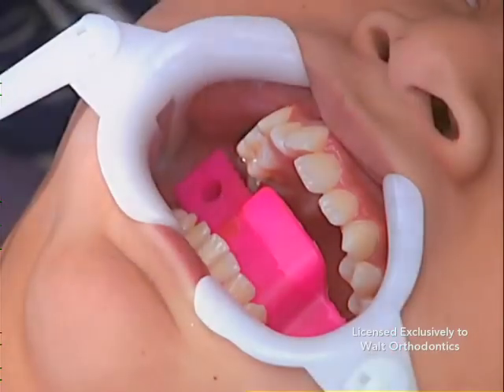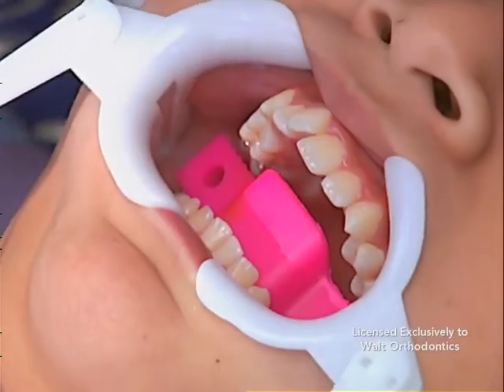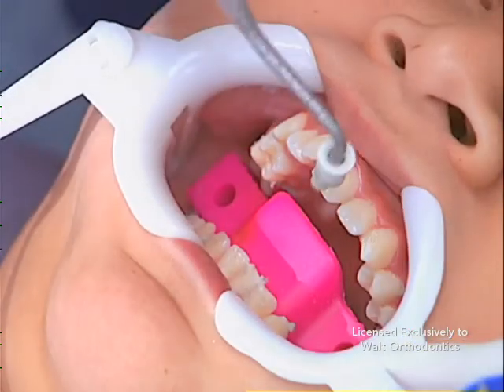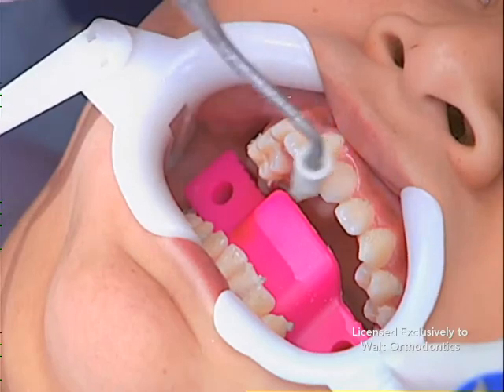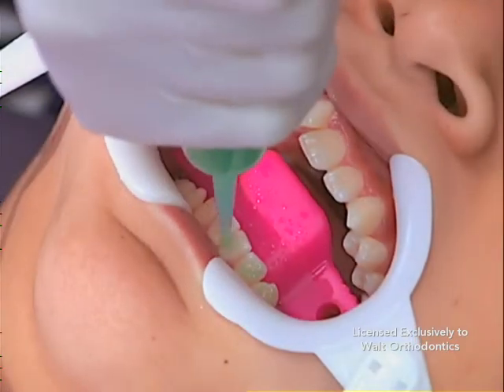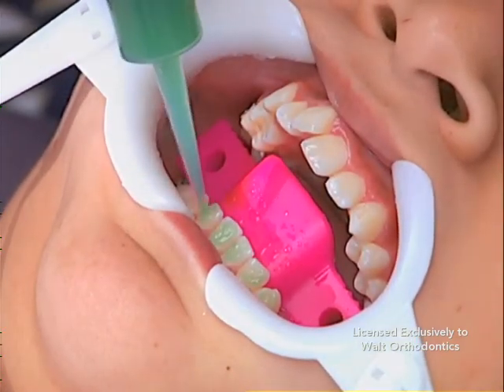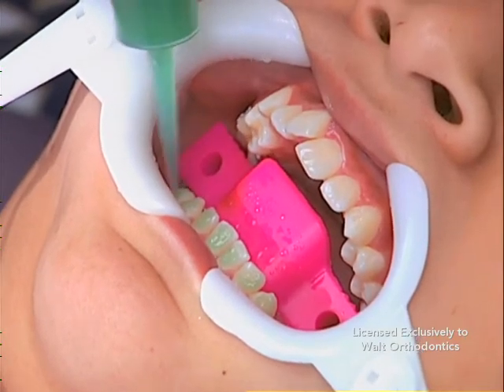Cheek expanders and a tongue suppression device are placed in the mouth to create the space necessary to manage and place the remaining appliances. Next, the teeth are thoroughly cleaned to remove any plaque or debris to help assure secure bonding. Once cleaned, you will be asked to thoroughly rinse your mouth. An etching material is then applied to the surface of each tooth. This prepares the surface of your teeth for the bonding agent that will hold the braces in position during treatment.